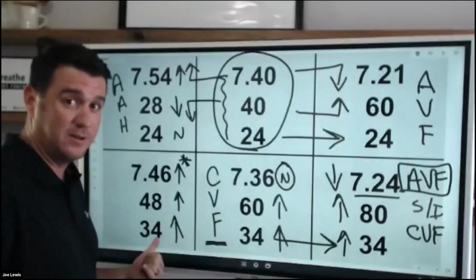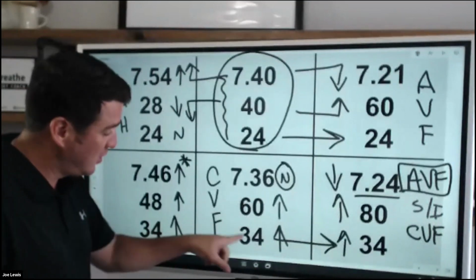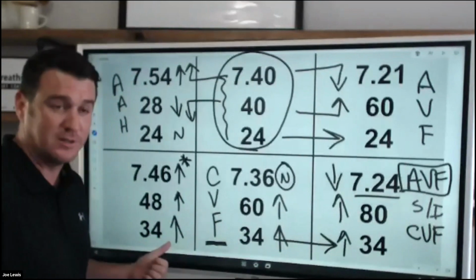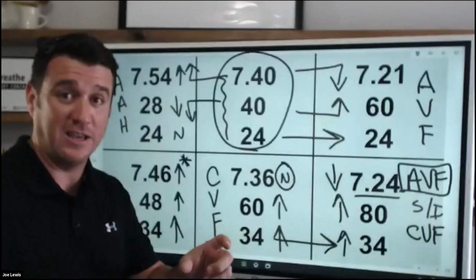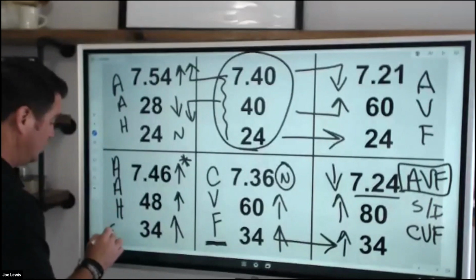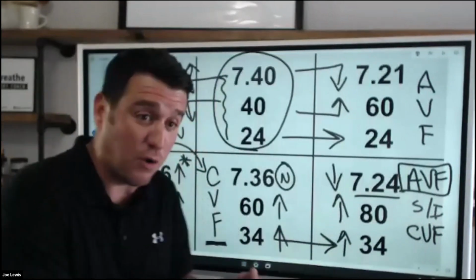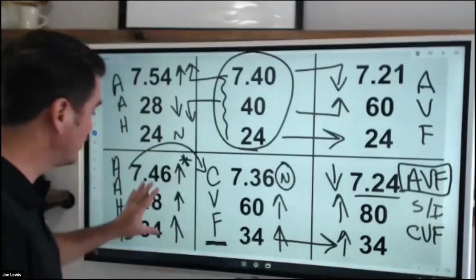I don't think so. This is a respiratory disturbance superimposed on chronic vent failure, even though it traditionally interprets into a metabolic problem. That's why that asterisk is there. It's the hardest one to recognize. Okay, so this is AAH superimposed on chronic vent failure. We know that. That's what it is. This is a chronic patient who is hyperventilating 100%.